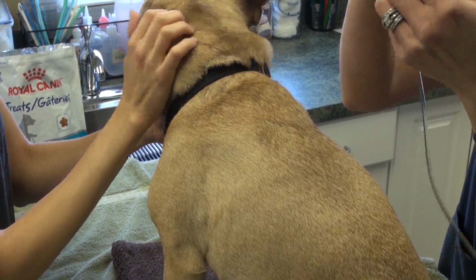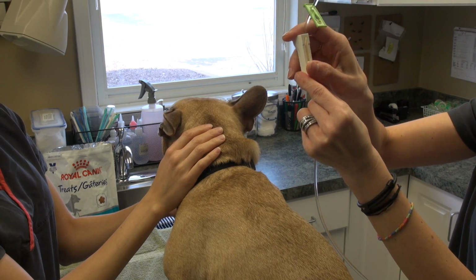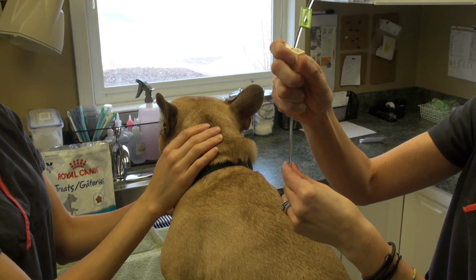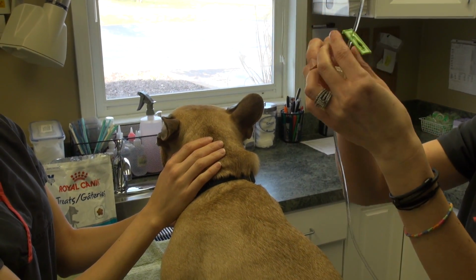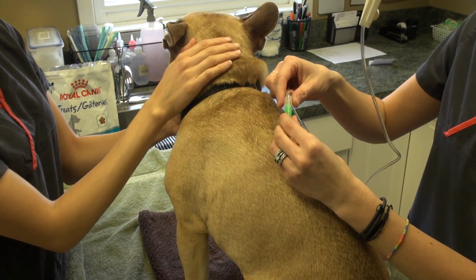Again, I have my fluid bag. I have 2 clamps going. This one again rolls, so if you can move it, that means the line is open. If you roll it down and you can't move it, that means it's closed. I also have this clamped as well, so no fluids are gonna come out. So we have the needle again, just be careful not to poke yourself.